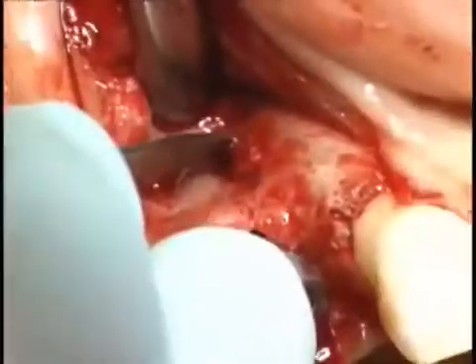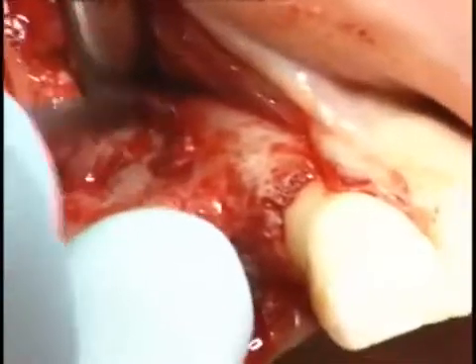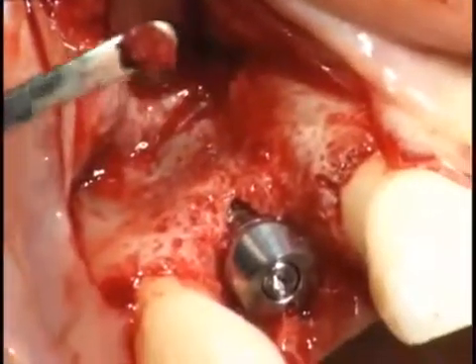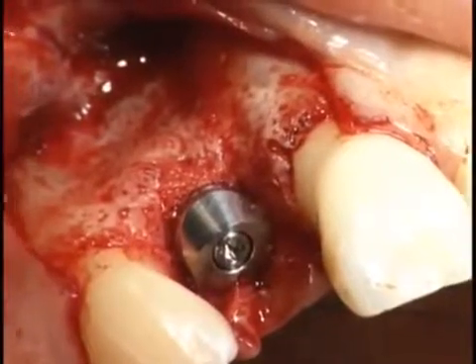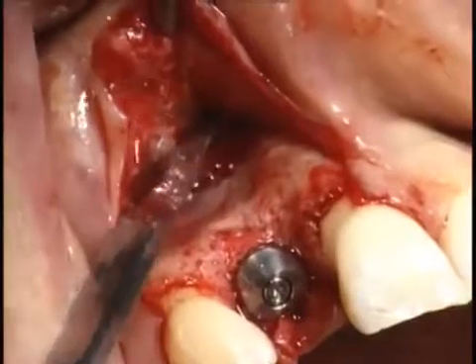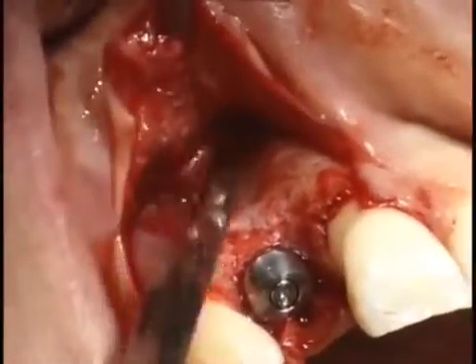The marginal bone defect on the vestibular side is now augmented with autologous bone chips. Small chips can be taken directly from the immediate surroundings of the basal alveolar process with a sharp periosteal elevator. A membrane can be omitted, but the mucoperiosteal flap is relieved basally by a slit in the periosteum. This ensures tension-free wound approximation.